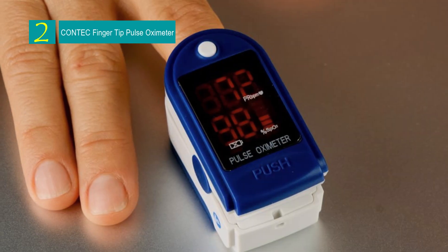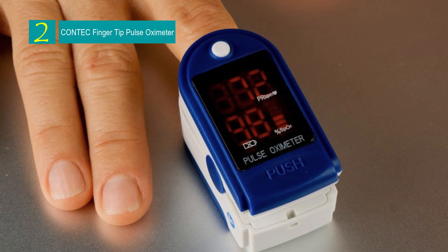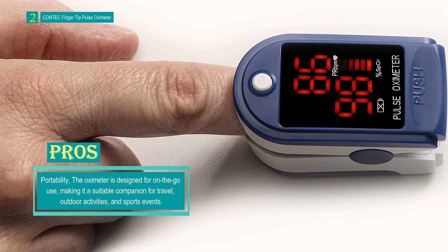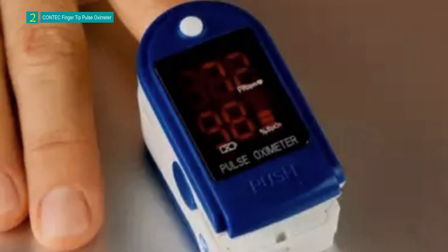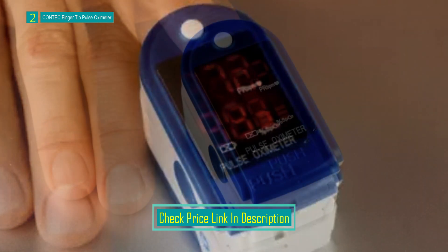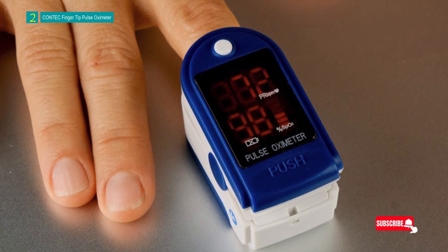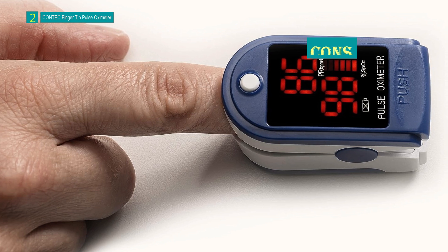Number 2: the CONTEC Fingertip Pulse Oximeter. This compact and portable device offers a quick and accurate method for spot-checking blood oxygen saturation levels and pulse rate while on the move, serving as a reliable travel companion. The oximeter features easy one-button operation, allowing users to turn it on and off effortlessly. With its integrated SpO2 probe and processing display module, users can get readings within seconds. The device is powered by two AAA batteries and offers approximately 30 hours of continuous monitoring. Features include a SpO2 and pulse rate bar graph, a bright LED display, low battery level indication, and an auto-power-off function after five seconds of inactivity.